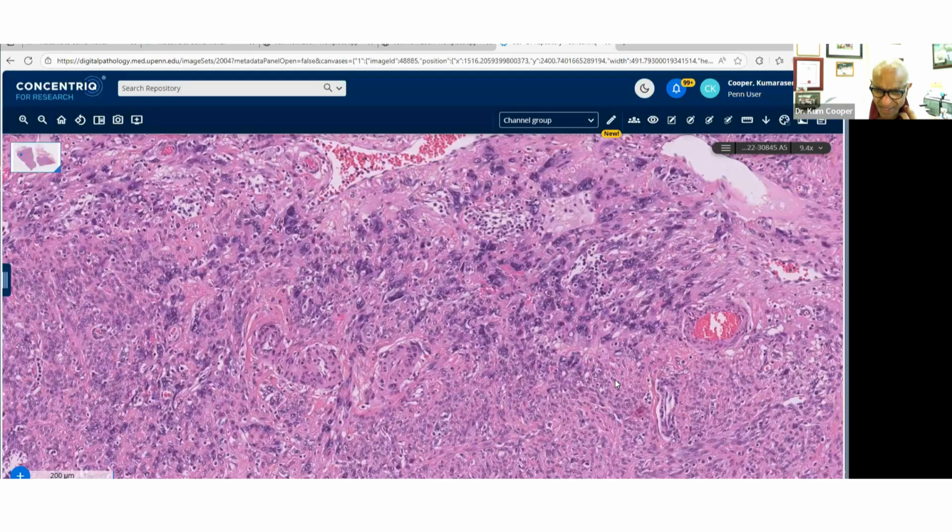And so in interpreting, if I take this and put it into the GYN tract, what would I call it? That's what I began thinking about. And the name I coined was extrauterine adenomyoma with bizarre atypia of Mullerian origin.